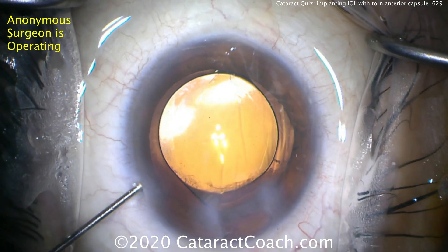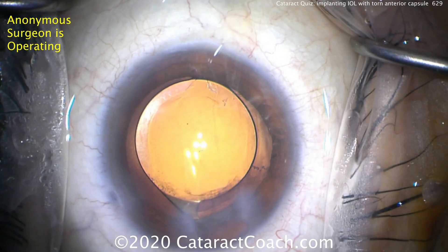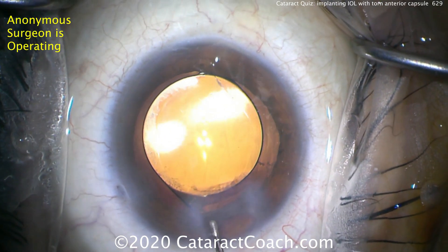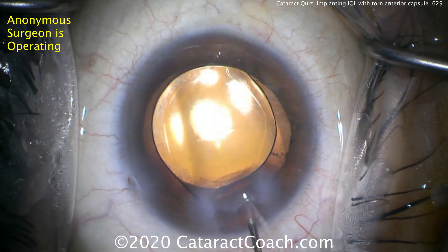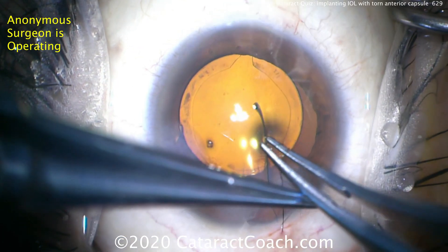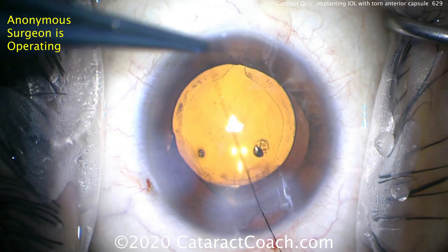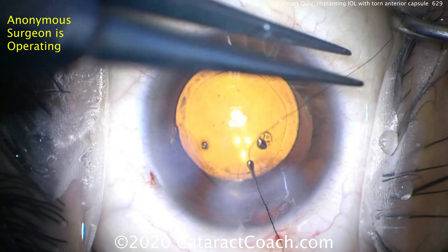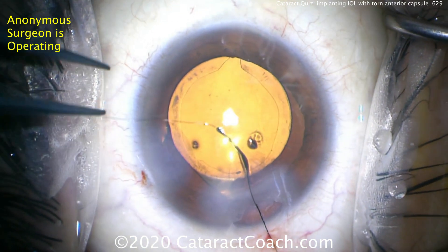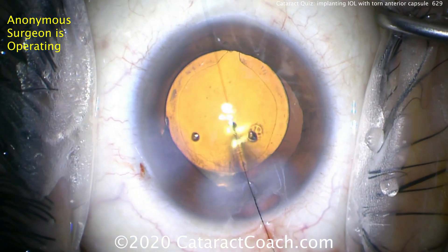Now hydrating the incisions even more, getting the pressure where you want it. That lens position looks great and this patient is going to have a beautiful outcome. A little extra hydration of the main incision — if you have any doubts, do what we're doing here: place a suture. It's very easy to place on the OR table and ensures that this incision is not going to leak.